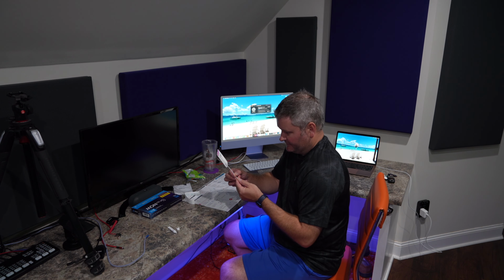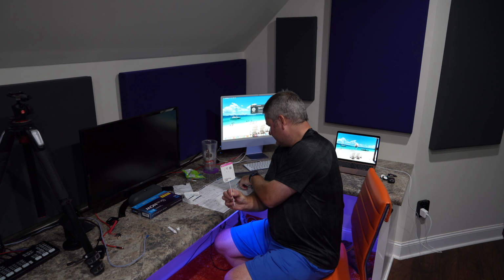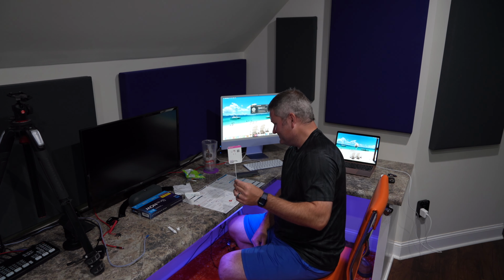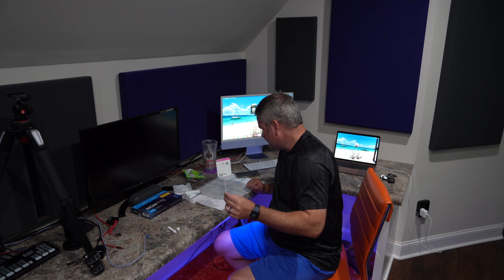And in good light here, the only thing that's present is the control line at the top. So that's the control. It's above the notch. There is no visible line below the notch, whether faintly visible or pronounced. There's nothing there. So I am COVID negative, dude. I'm COVID negative. But I've got another one of these if I ever have a fever or scratchy throat and I'm afraid I might have COVID. This wasn't as unpleasant as I thought it would be.